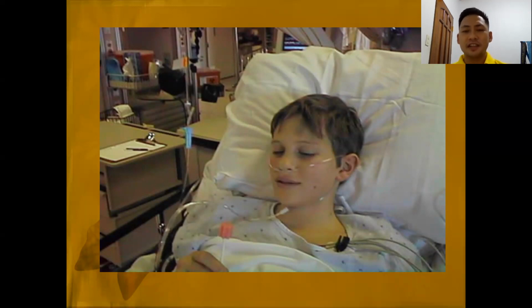putting this nasal cannula on the patient, you have to ensure first that the proper regulation in the flow meter is considered, and the doctor's order is considered. Remember, oxygen is also considered a medication, so it is ordered by the physician. But in an emergency situation, we can administer oxygen up to 2 liters per minute.